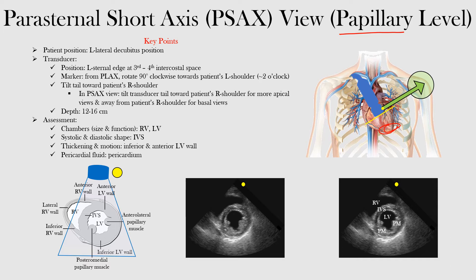We have the patient in the left lateral decubitus position. We have the transducer positioned at the left sternal edge between the third and fourth intercostal space — that's usually optimal. And then you want the marker. If you remember the parasternal long axis view, recall this is the right shoulder of the patient, this is the left side of the patient. What we had in the parasternal long axis view, we had the transducer marker directed towards the right shoulder.